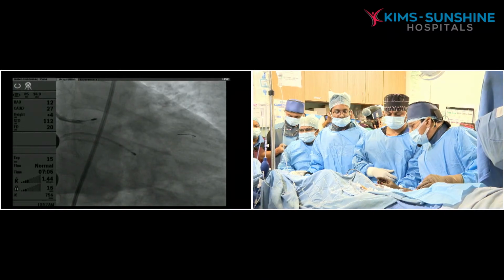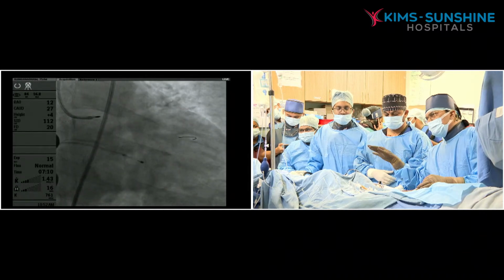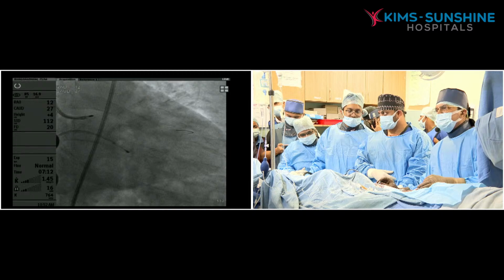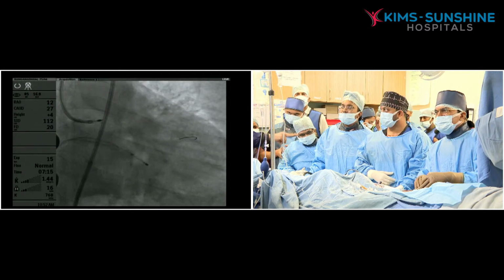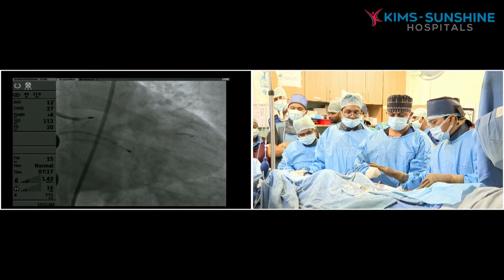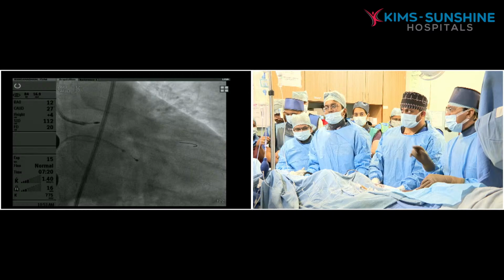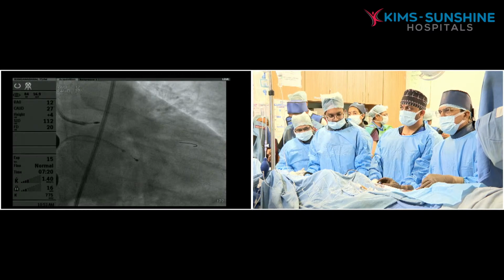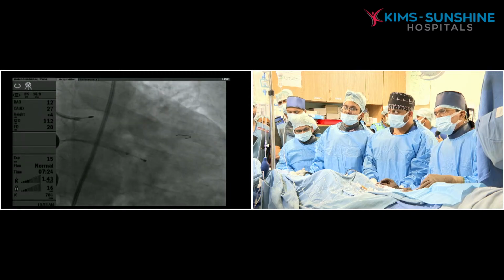Unlock. Okay, 1 minute. No, before you do it, always pull and then start it. Now I'll start. No, I will do it. What happens if you start with this one, it will jump. That's the reason I started with that one. All set, sir.